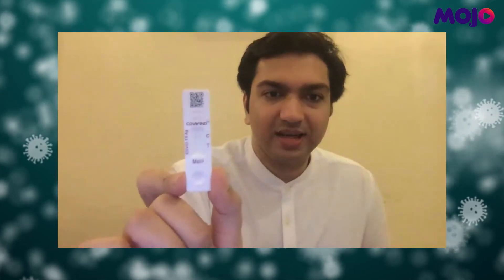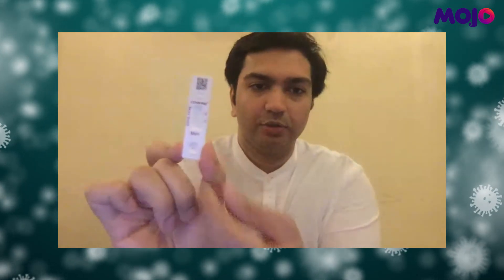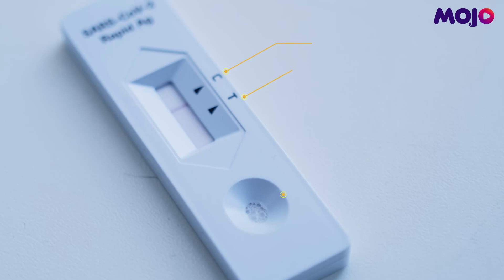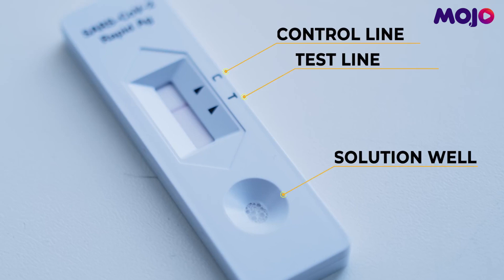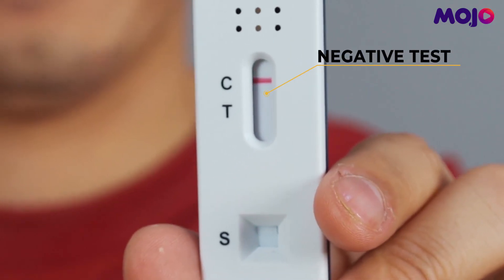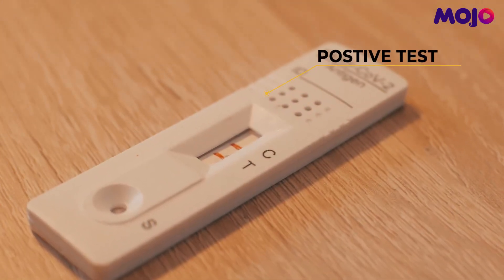This is the actual test kit. There's a QR code, there is a C and a T. There's a little well where you will put the solution. If there is a C line but no T line, it's a negative test. If there is a C line and a T line, it's a positive test. It's very important to be mindful that even a very faint T line counts as a positive result.